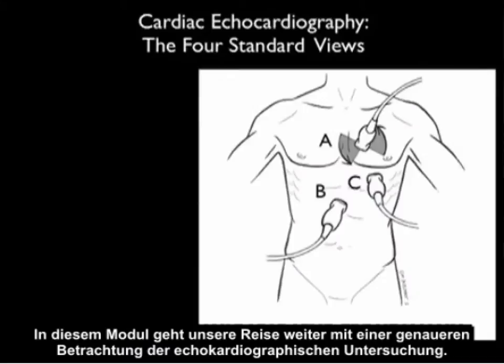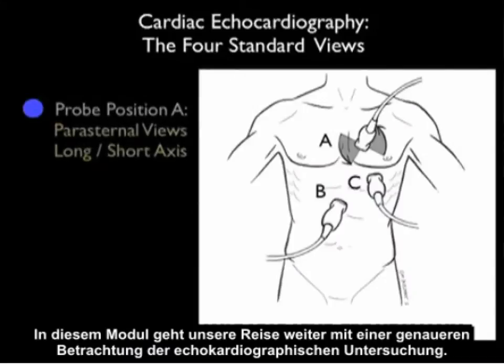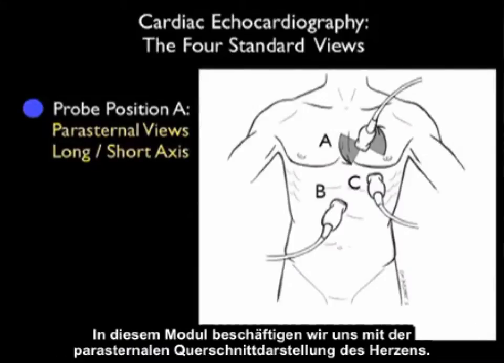In this module, we'll continue our journey looking specifically at the cardiac echo views of the heart. In this module, we're going to focus entirely on the parasternal short axis view of the heart.